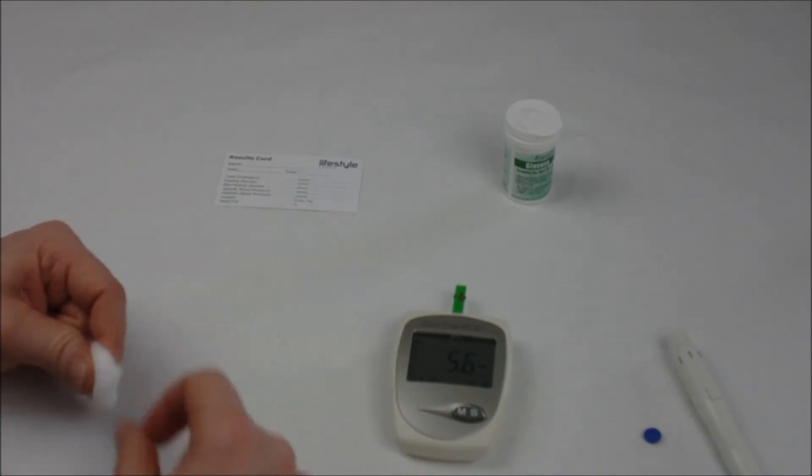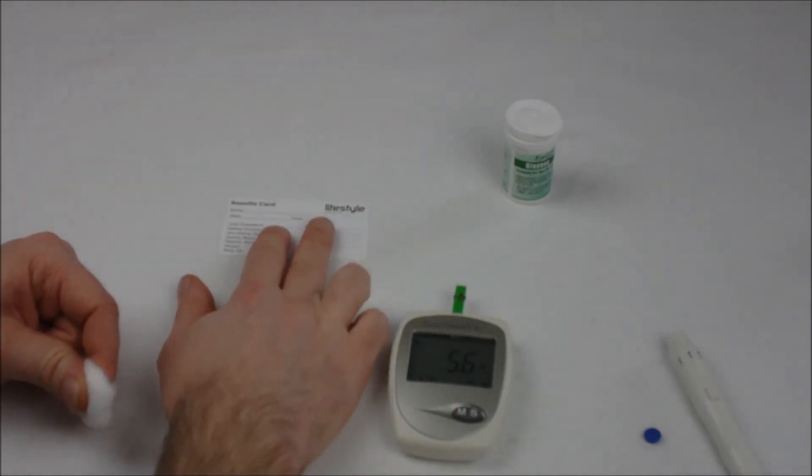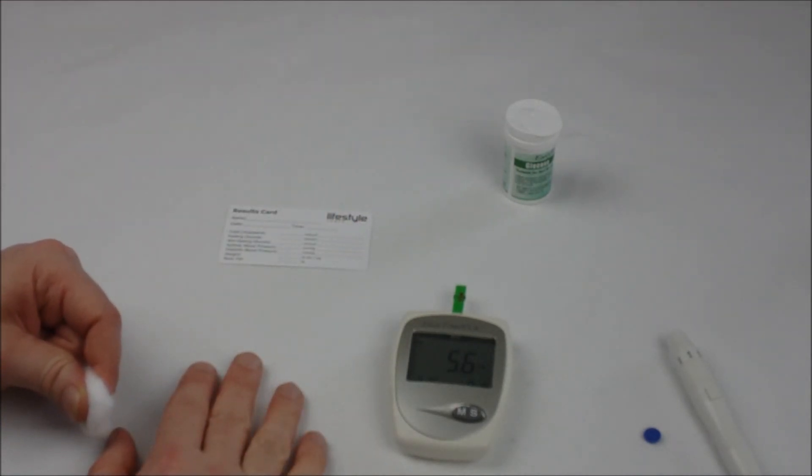Write your fasting blood glucose level down on your card, and then you can go to the website healthcheckinabox.com and enter that in at the results analysis page.